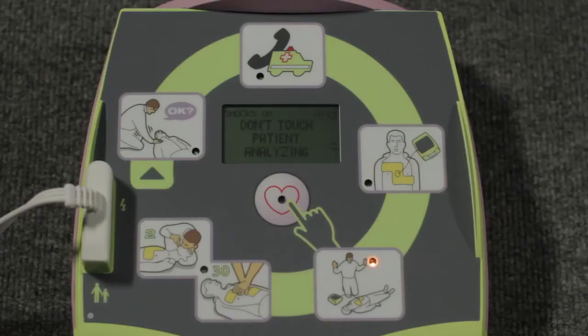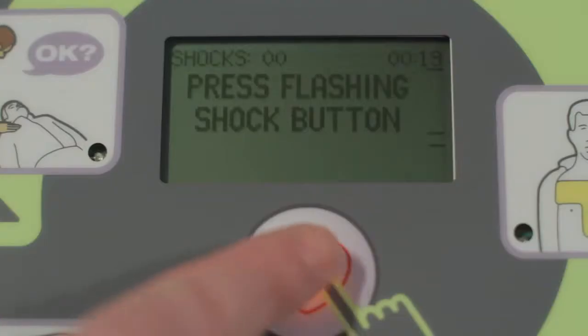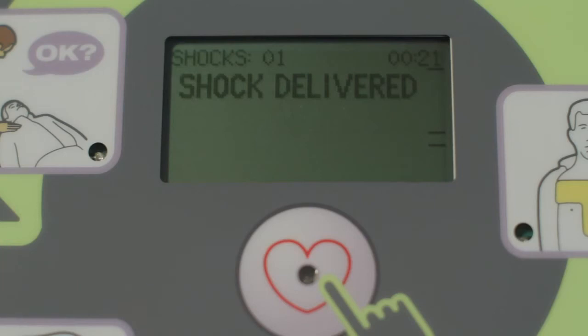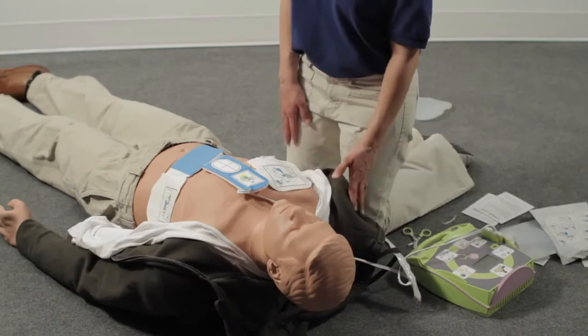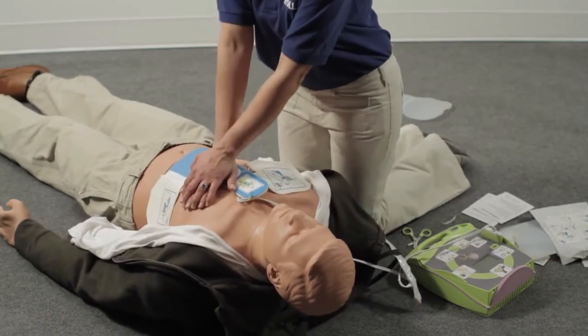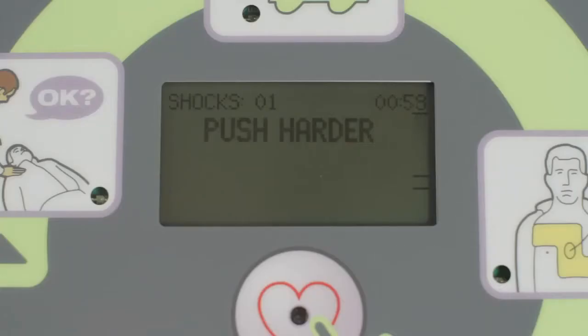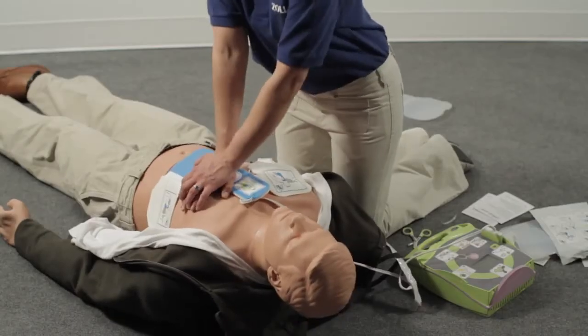Don't touch the patient while the AED is analyzing the heart. If a shock is needed, be sure that no one is touching the person. After the shock is delivered, immediately start CPR. Do your compressions by pushing down on the CPR landmark. If your compressions aren't at least 2 inches deep, the AED Plus will let you know every 15 seconds until you reach the target CPR depth.